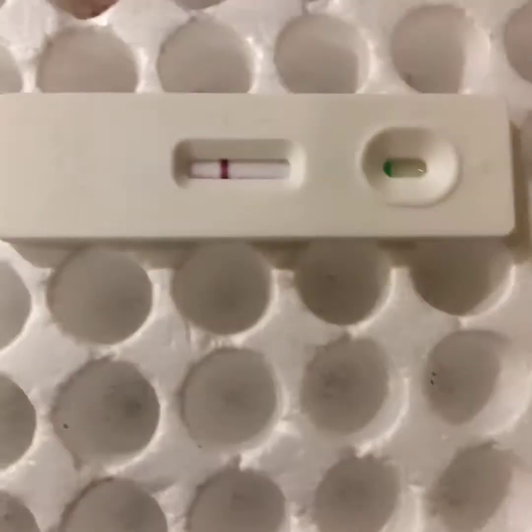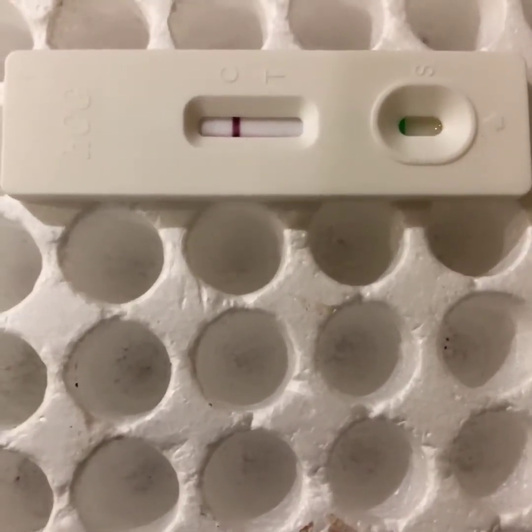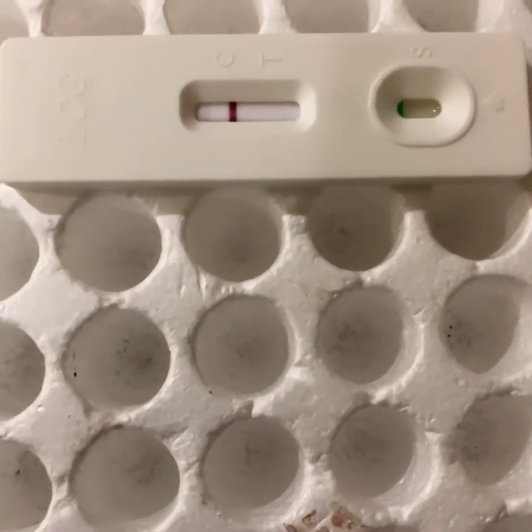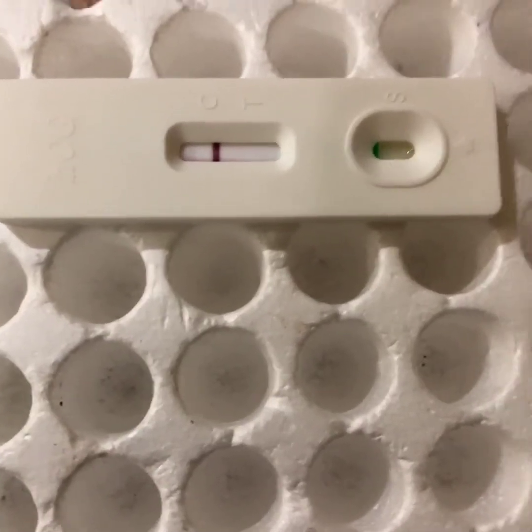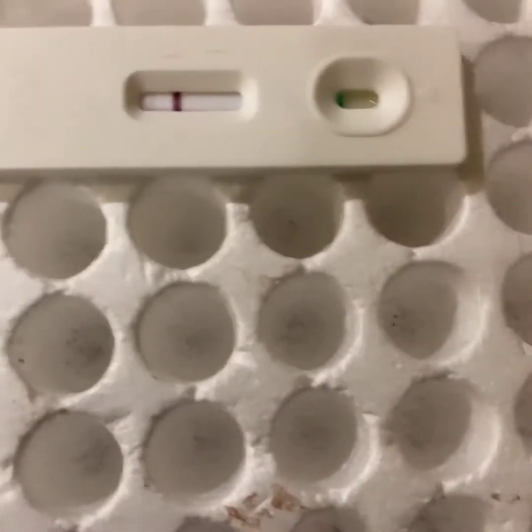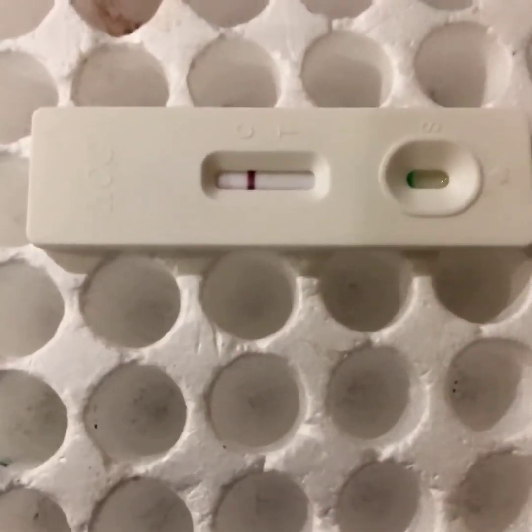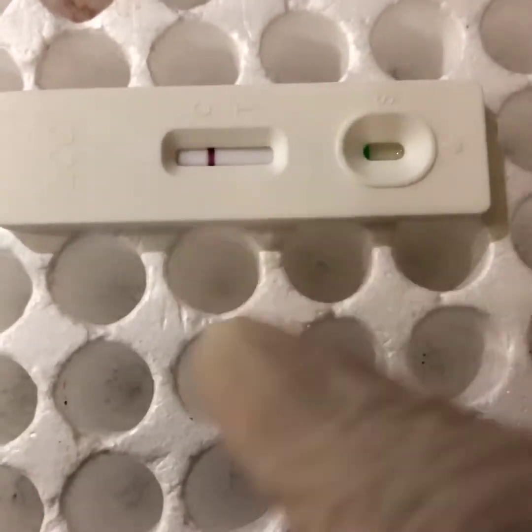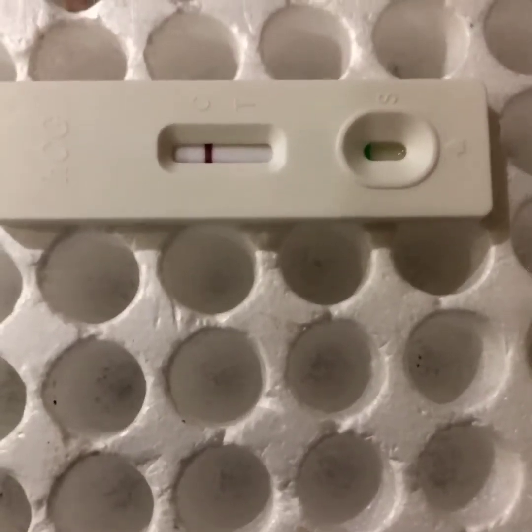The control line serves as our internal control, which always helps as part of the quality control program, to check the validity of our testing process. In order to accept the test result, your control line should have a purple band or line. If the test kit does not show a line on the control line, that would warrant the test being invalid.